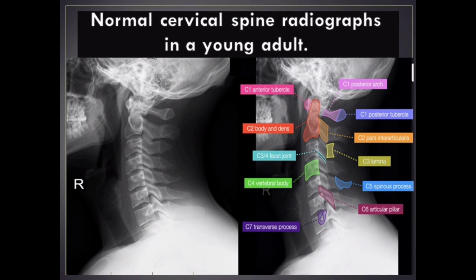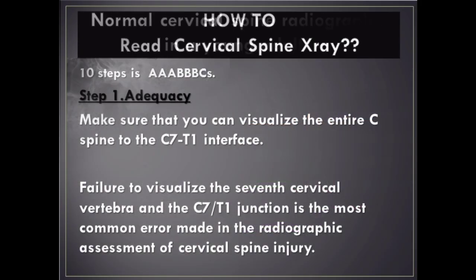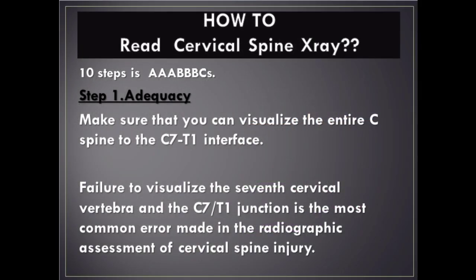Step 1 – Adequacy: Make sure that you can visualize the entire C-spine to the C7/T1 interface. Failure to visualize the seventh cervical vertebra and the C7/T1 junction is the most common error made in the radiographic assessment of cervical spine injury.